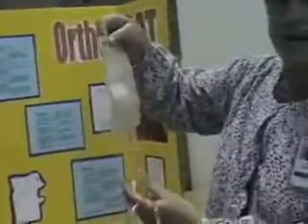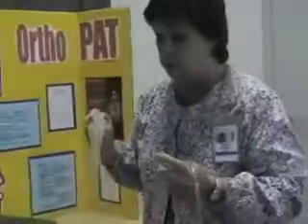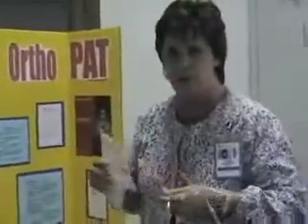And how much blood is usually in there if you fill it up? It varies quite a bit. There are markings so you can see how much you do have. Sometimes there's as little as 25. Sometimes there'd be a couple hundred in there. Sometimes the total knees put out quite a bit, and the bilateral total knees put out really a lot. So it's really a savings for them to get their own blood back. Correct. So generally it's used for the first probably 12 hours post-op, and then it's changed to a hemovac.